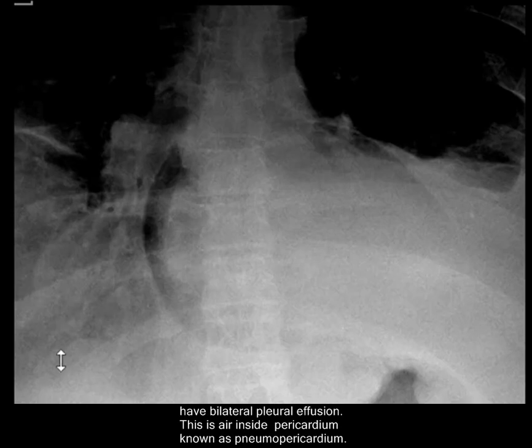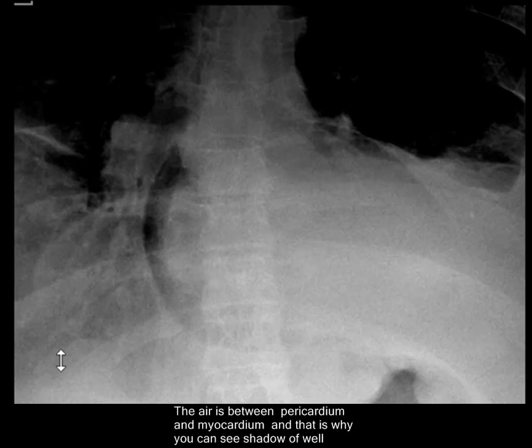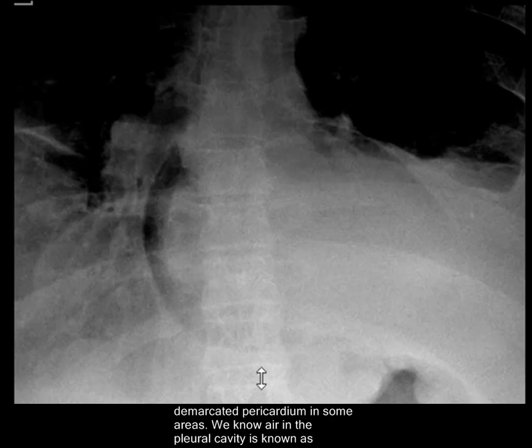This is air inside the pericardium, also known as pneumopericardium. The air is between the pericardium and myocardium, and that is why you can see the shadow of a well-demarcated pericardium in some areas.